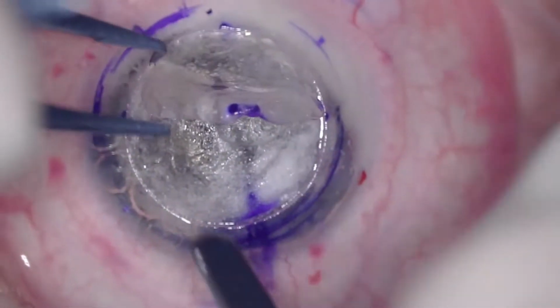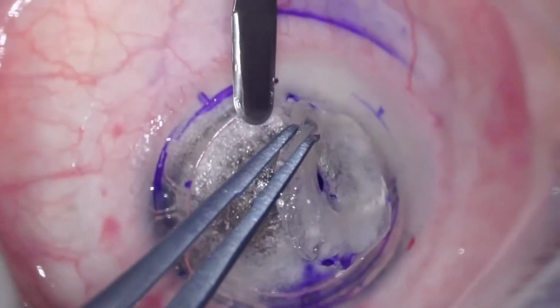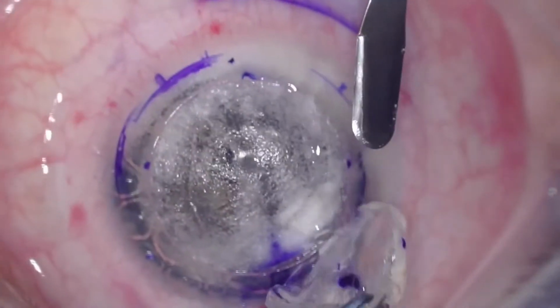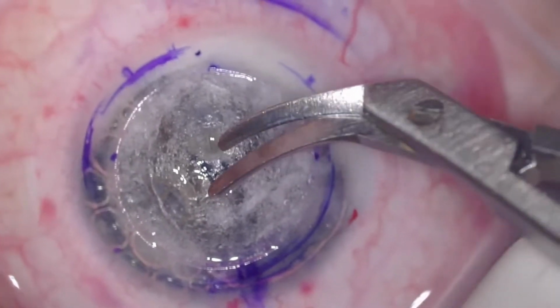graft. So I'm just finishing off the removal of the anterior stromal cap, being very careful not to go beyond the margins of the trephination. It's important with a sharp blade such as the crescent knife not to create separate dissections, and make sure you stay within the boundaries of the trephination.